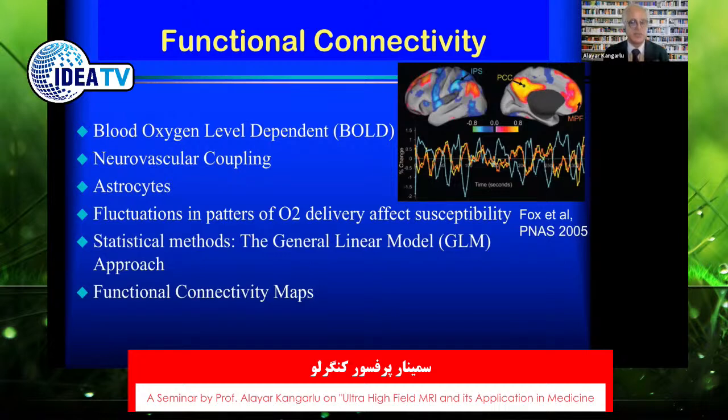And then through the functional connectivity map of the brain, and looking at the delay between the neuronal activity and the hemodynamic activity, which is the bread and butter of fMRI, we could perhaps shed some light on the neurovascular coupling and the role of astrocytes in the neurovascular coupling. This is probably the last missing key in empowering fMRI and taking it to the next level, to see whether astrocytes are playing a role.